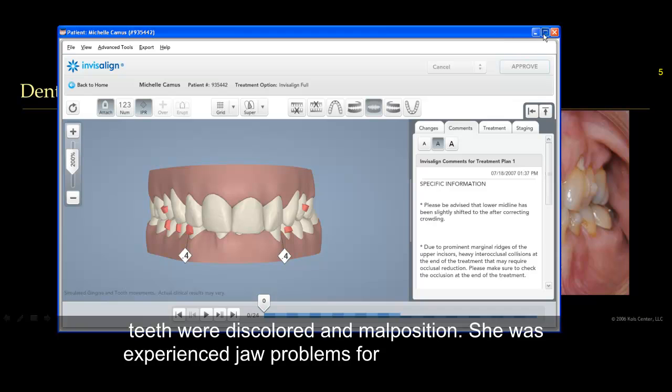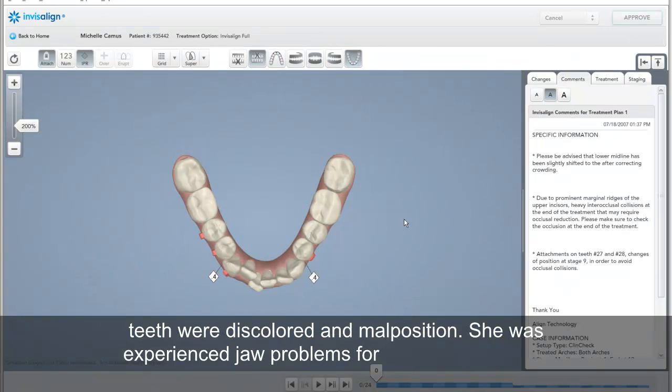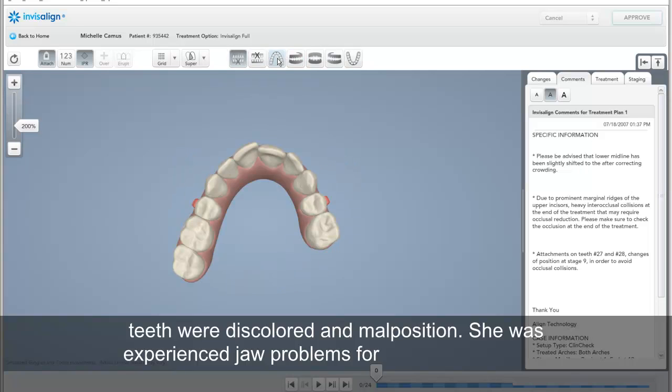If you look at the screen, let me show you what the bottom teeth look like. You see, number 25 was completely facially, labially positioned, and you can see number 8 is also positioned labially. So I told you before we start any restorative procedure from 7 to 10, at least we have to do Invisalign, put them in the right position so I can align them properly. So we have to grind less and do fewer root canals.